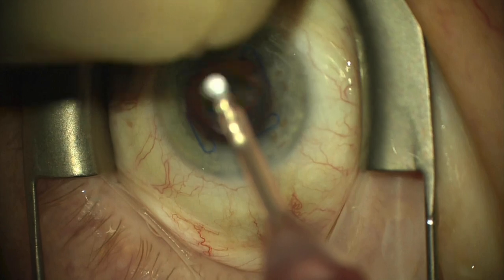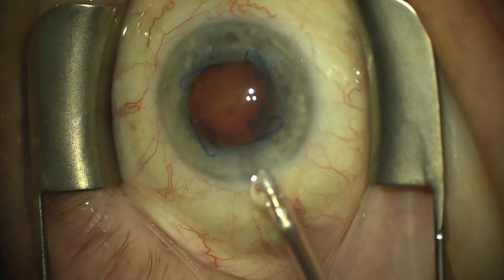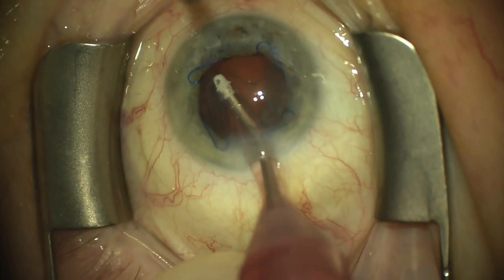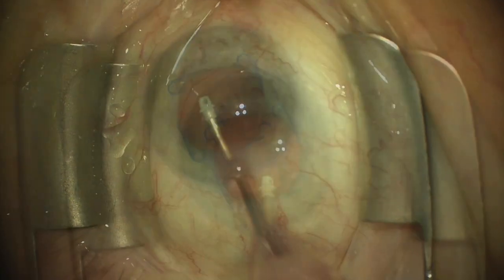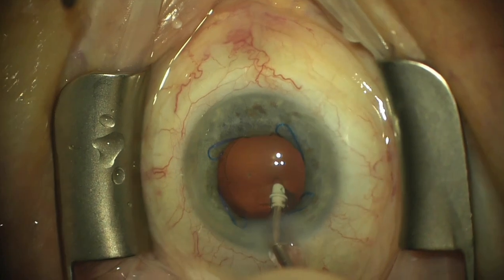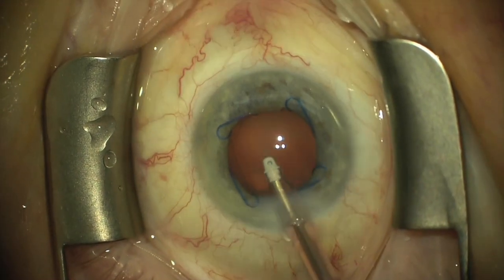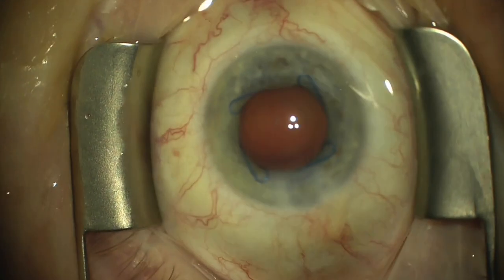This is the most efficient thing to do rather than reflux the capsule off the IA tip and go fishing for it later. This case was presented to emphasize the step of ensuring the entire anterior capsular material is removed at the conclusion of the Rhexis. There have been cases where this is not done and the anterior capsular material is found stuck in the corneal wound or floating in the AC on post-op day one. So get used to ensuring the step is done correctly and make it part of your routine. This patient had a great outcome with 20/20 vision post-op day one and enhanced quality of life.